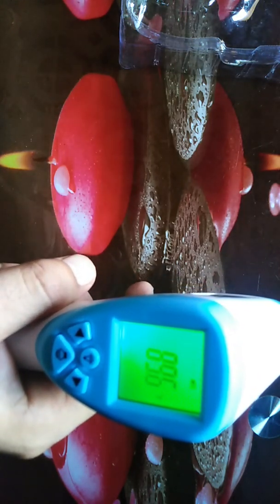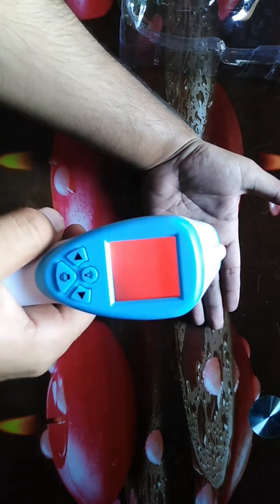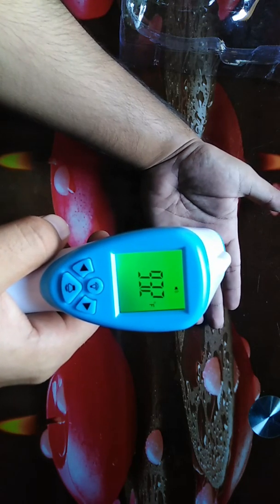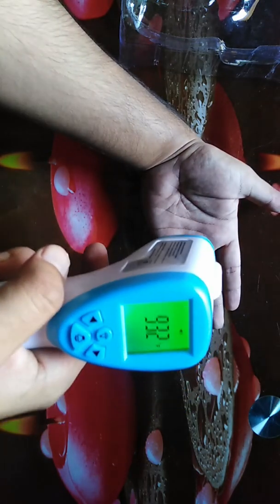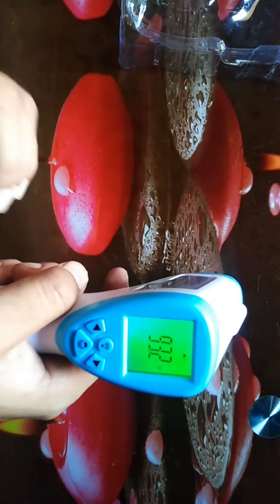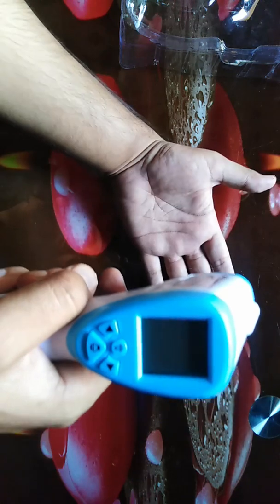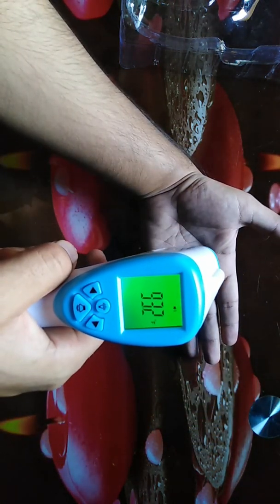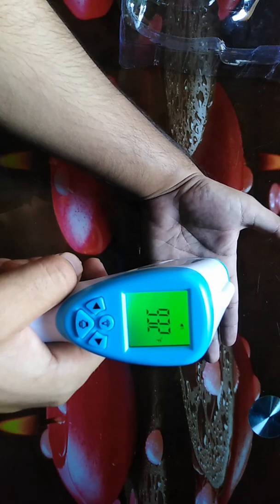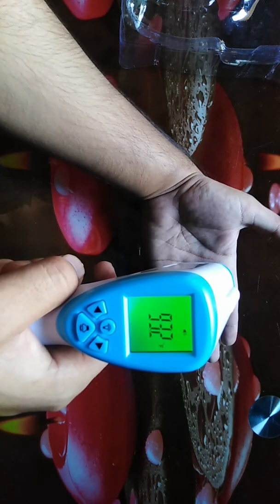To measure body temperature, you don't need to make physical contact. For example, measuring my own temperature — it shows 93°F. You can measure the temperature of different objects by placing it in front of the object. For accuracy, you should repeat the process three times. First time it shows 93.2, second time 93.2, and again it shows 93.2.